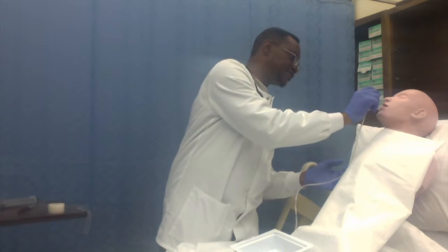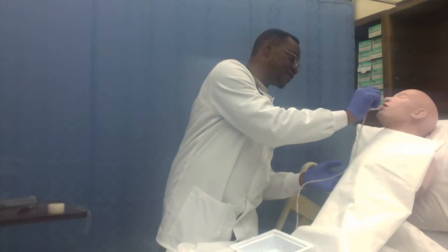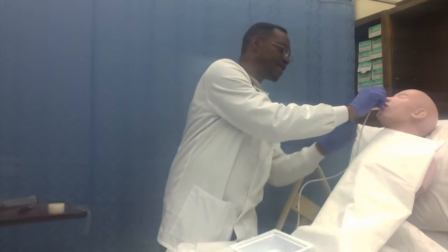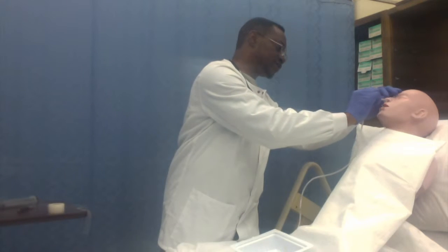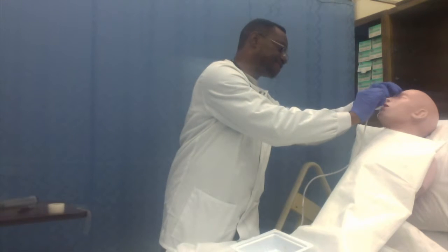gently, inserting about 1 centimeter at a time. When I get down to the pharynx, I will ask the patient to tilt his head forward towards his chest so that the tube can have an easier way down. Then I will continue to insert 1 inch at a time.